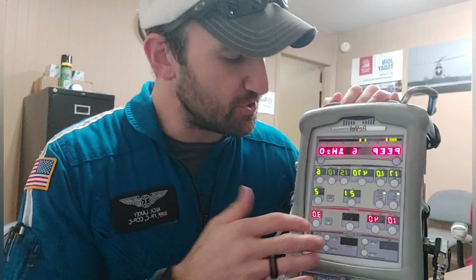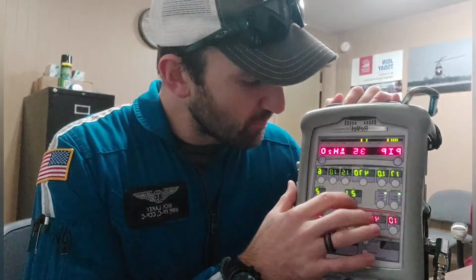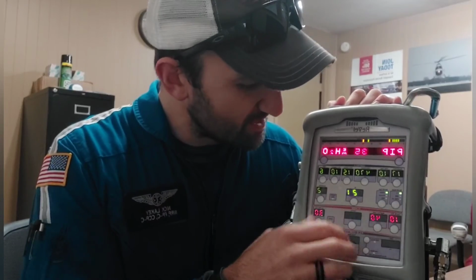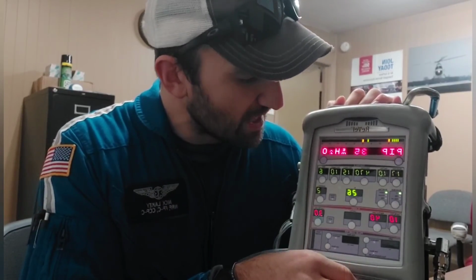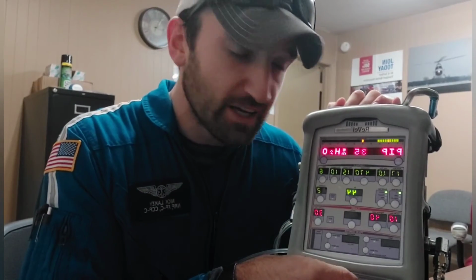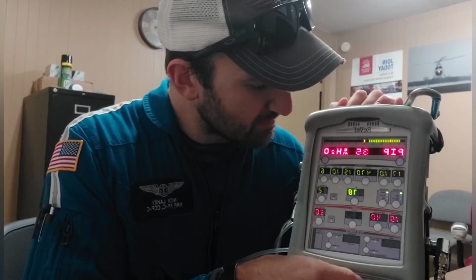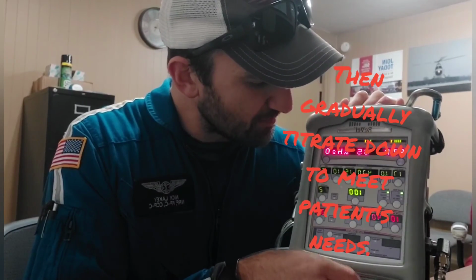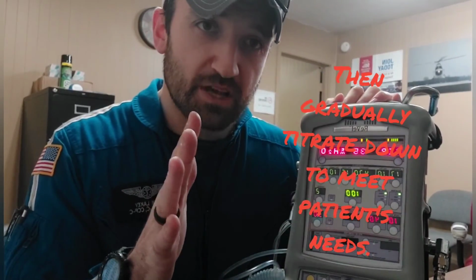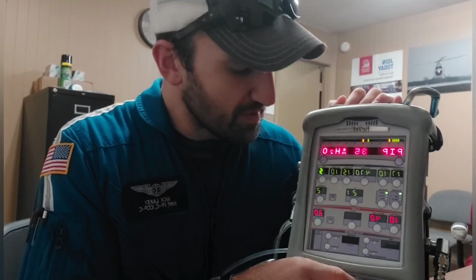So the next thing that I would do here is, since I just hooked the patient up to the ventilator, we really want to take this, and this is going to alarm, guys, and the reason for that is because I'm not hooked up to an external oxygen source. So I'm taking it off of room air. We're going to take it up to 100%. It'll take me a second here to get up there, but we're going to take it up to 100%, okay? And then the next thing that we do is we take our PEEP, and I'd probably start that PEEP somewhere around 5. So pretty simple.